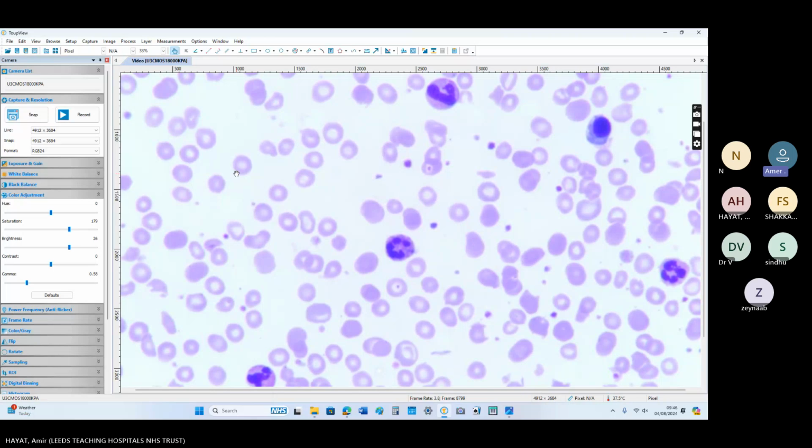So you have mentioned three or four causes of MAHA. Okay, then your report is complete. Sometimes the blood film is from the GP. Then you have to address the GP in your report, that this patient needs further investigation or referral to hematology, or this is an emergency and needs to be transferred to hematology as soon as possible. So depending on the scenario, whether the patient is in the hospital or the blood film is from the GP, you have to address accordingly in the exam.